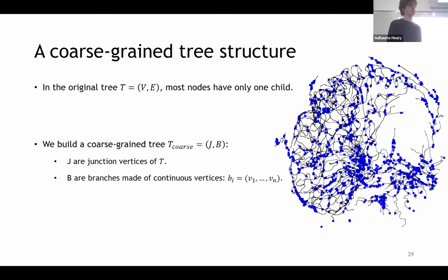So in order to avoid that, we'll rely on a tessellation method, where we split the embedding space into small subspaces that partition the original space, and in which we force the sub-trees to be contained.